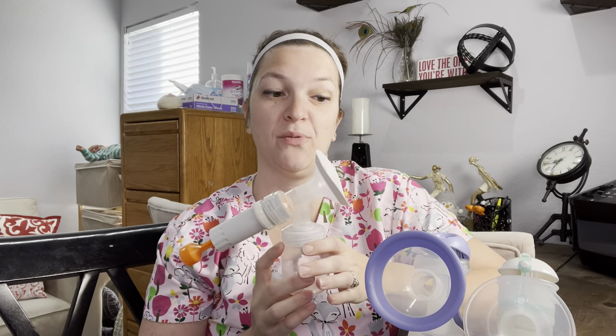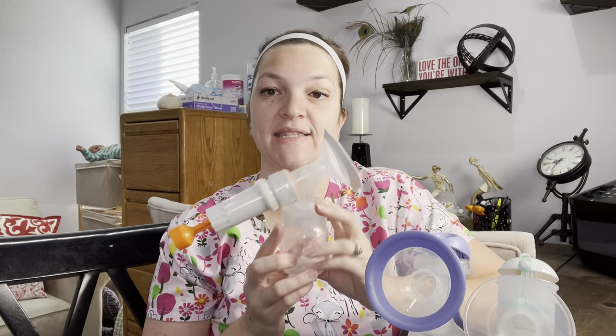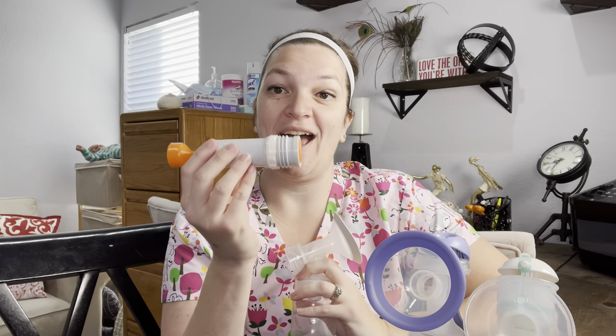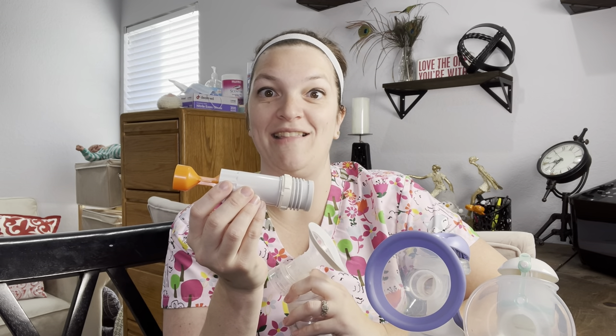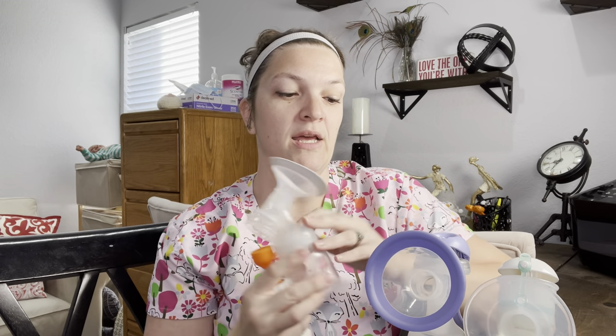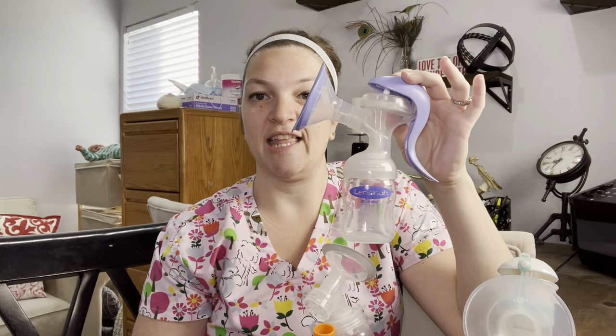There are many different brands of hand pumps. This is a piston pump — this one is by Hygieia. Medela also makes one that is yellow that you may get in the hospital; a lot of hospitals will hand them out because they're super cheap to make. Then there's the Lansinoh and the Evenflo. It's literally just a bottle attached to your flange with your membrane or duck bill in it to generate your suction.